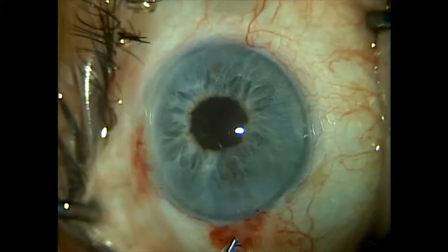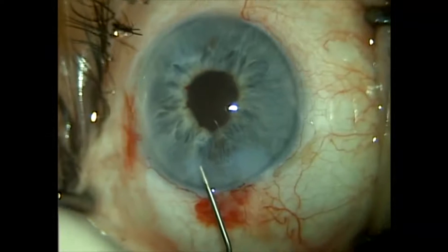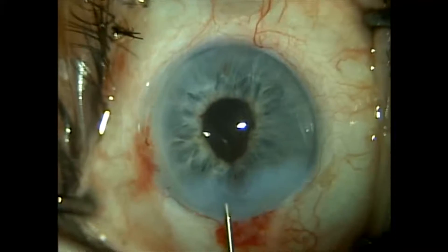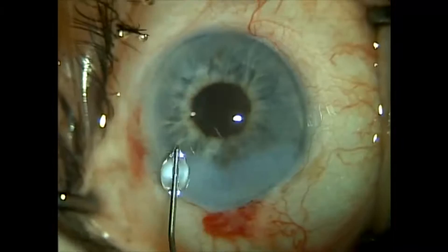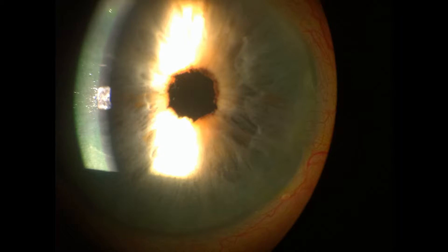At the end of the case we've got our normal physiologic miotic pupil. As we try to hydrate and inflate the anterior chamber, we can see the iris wanting to herniate out of the keratome incision, but we're able to manage it. We've got a nice case. Post-operatively, this is the photograph at the slit lamp — that's the normal pupil on post-op day one. The cornea looks good, the pupil looks good, the eye looks quiet. Thank you for your time.